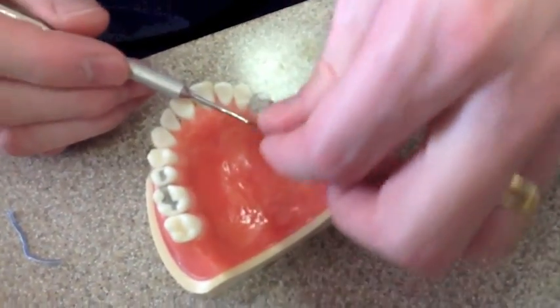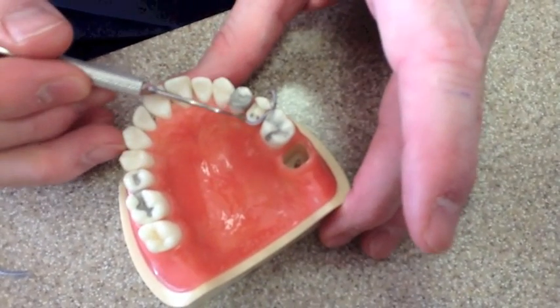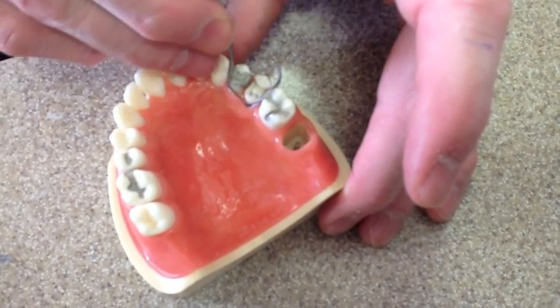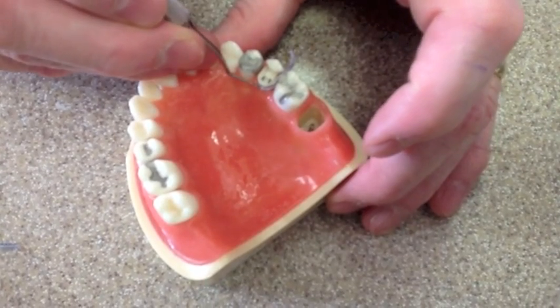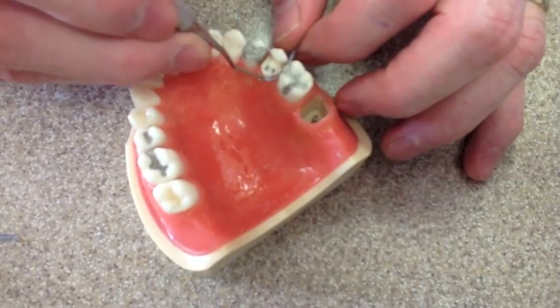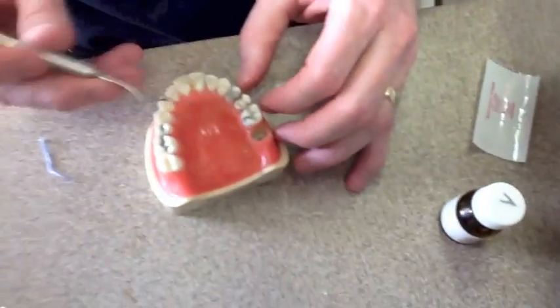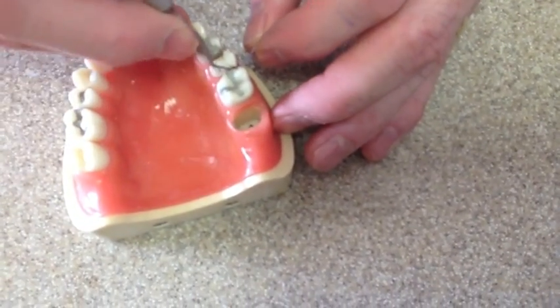I'm going to pull this string. I always like to kind of pull it around like that so it's in place. And I'm going to put that in there. I'm going to push it through there. It's not even close to the same on this typodont, so you're going to have to learn a lot of this in the mouth. But you can learn the correct angles at least coming in there. See how I'm pulling? Now I'm going to pull that tight and come between and pull it in there.